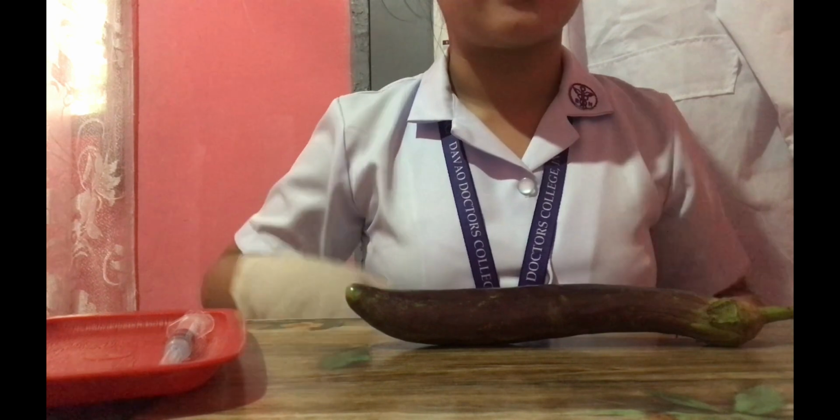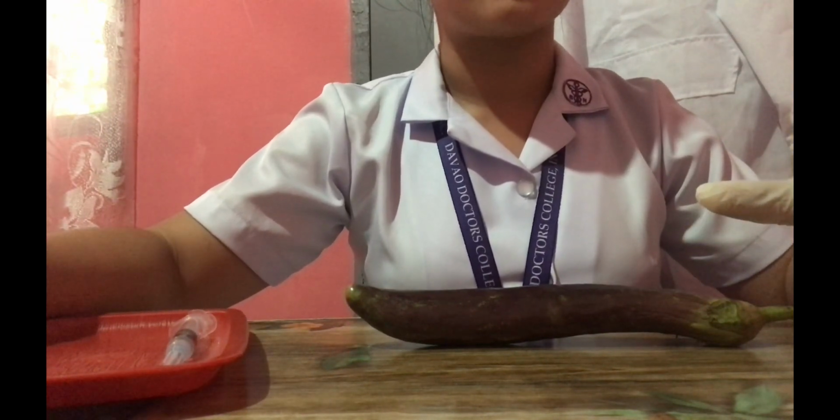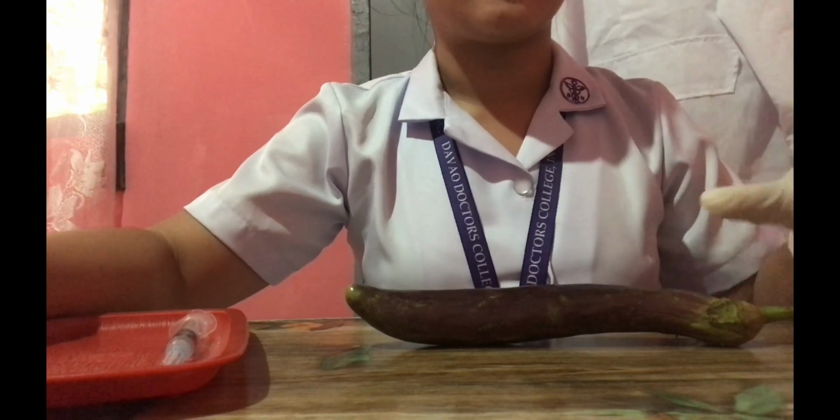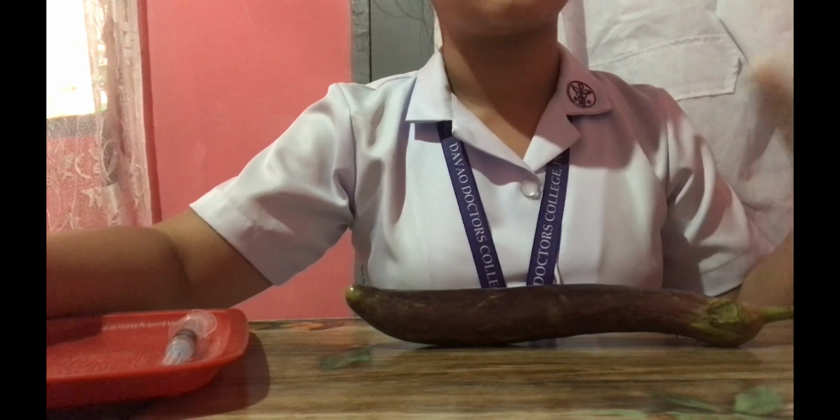Then clean the site with an aseptic swab using a circular motion. Start at the center and move outward about 5 centimeters or 2 inches.